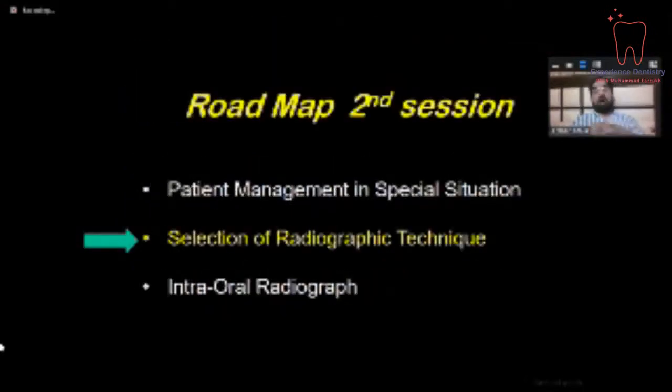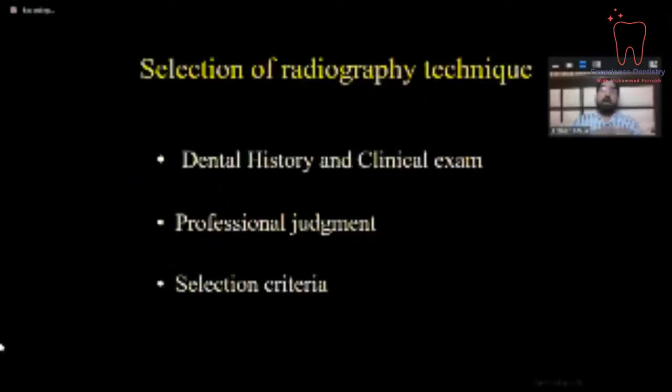This is all about the patient management in these patients. Now we are going to the start of the roadmap of today, that is the selection of the radiographic technique. For that purpose, you have to take a good dental history and clinical examination.